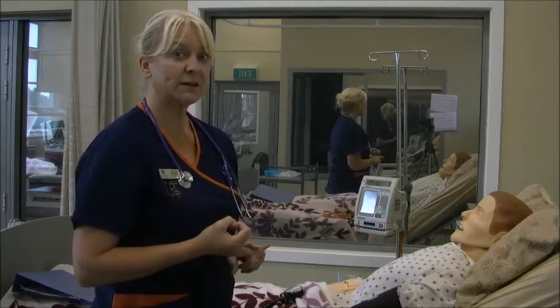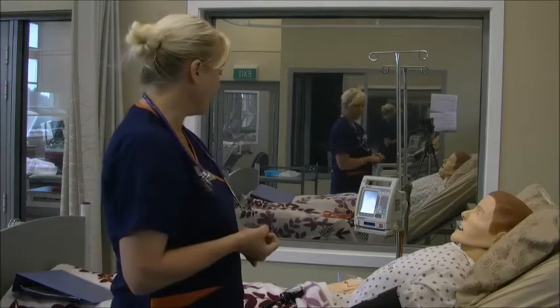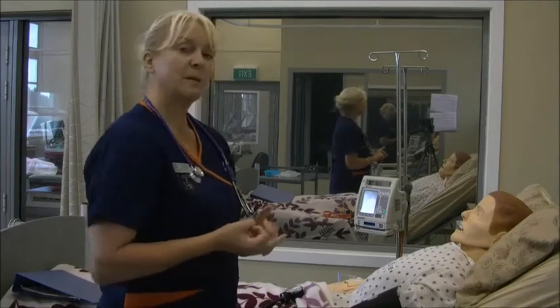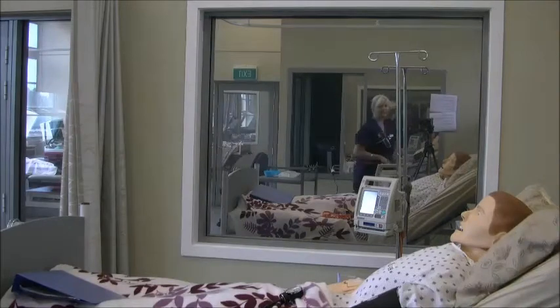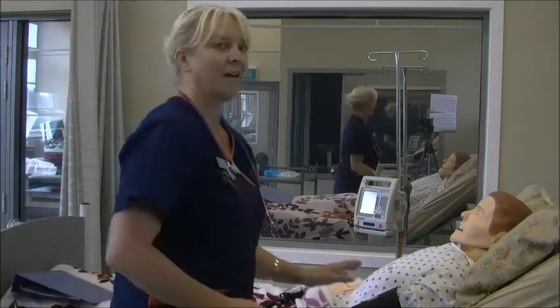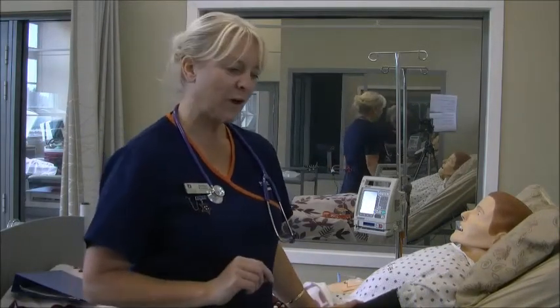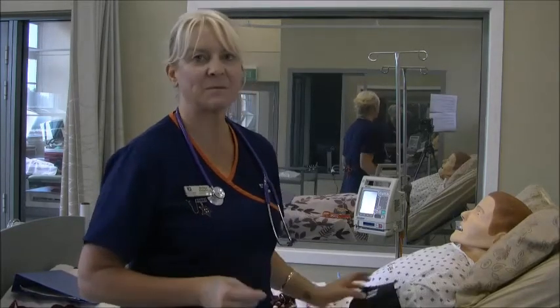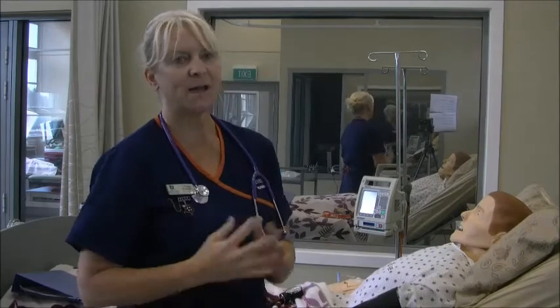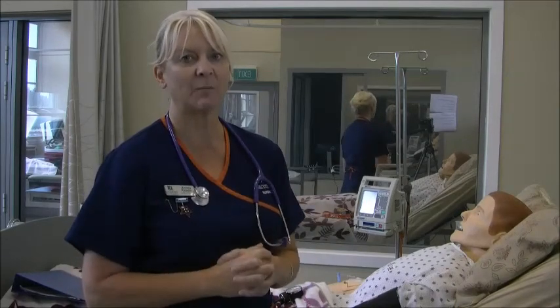His O2 SATs are 99% on room air. His blood pressure is 100/50. Okay, his blood pressure is 100/50, and I know that his pulse is 92 and his temperature is 37 degrees. So I have an idea of his stability at the moment.